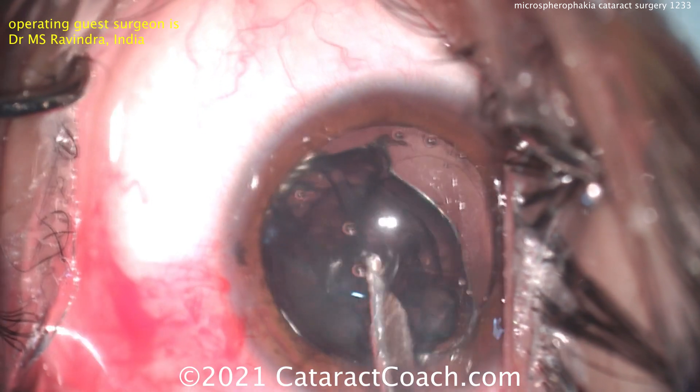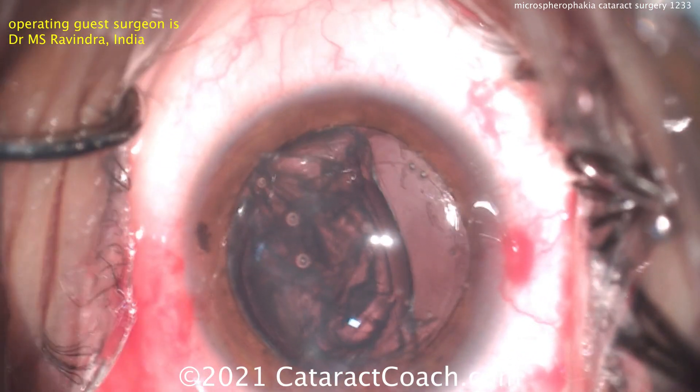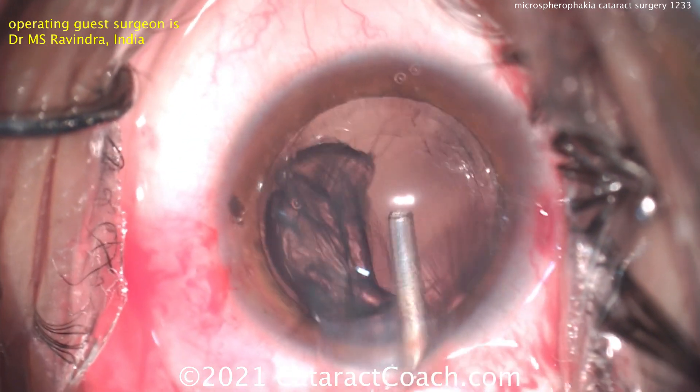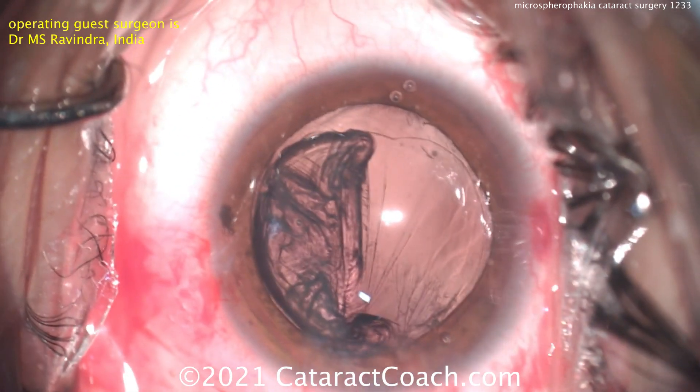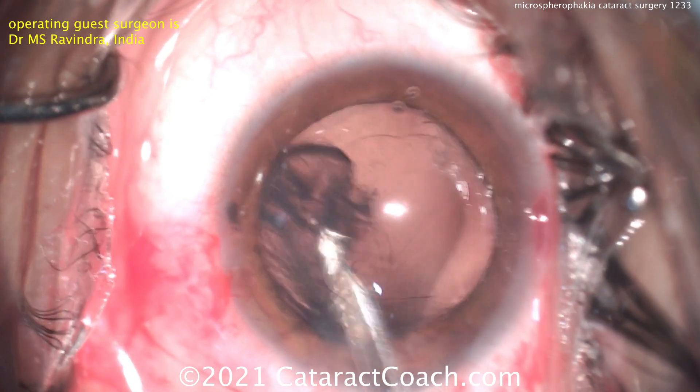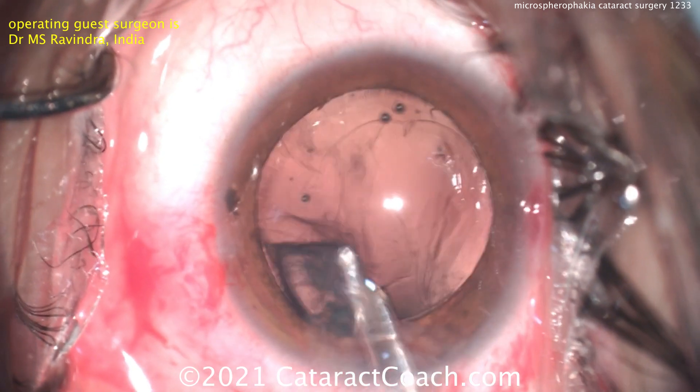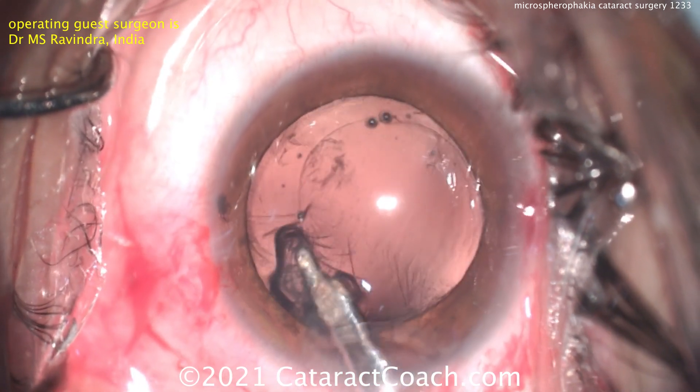You don't have to use a Simco cannula — you can use an automated IA probe — but certainly you don't need any ultrasonic energy. I like the visco-dissection technique to get the rest of that lens material up out of the capsule bag. And so now more vacuuming and cleaning up.